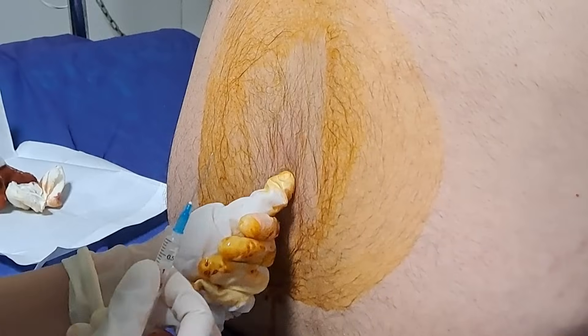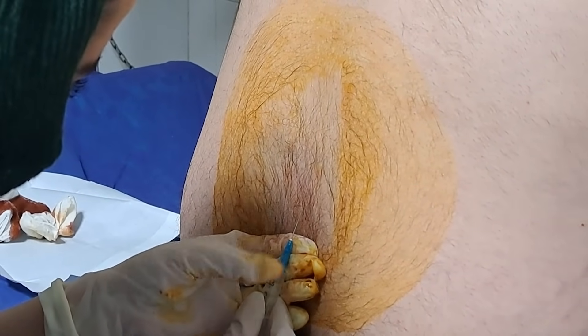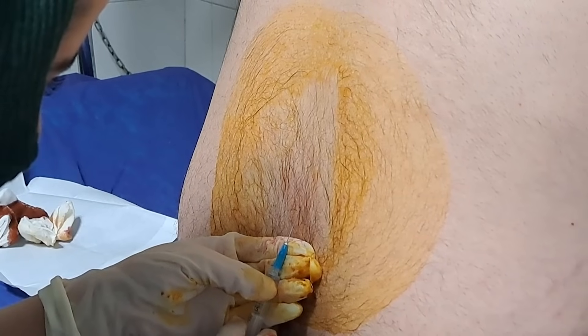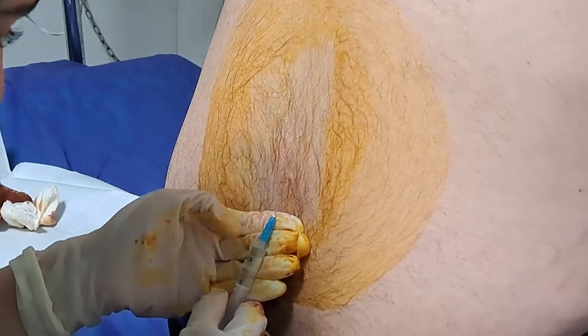Then we need to use an anesthetic medication to numb the area. This is done by injecting the medication at different points of the site while the needle is going into the spinal space.